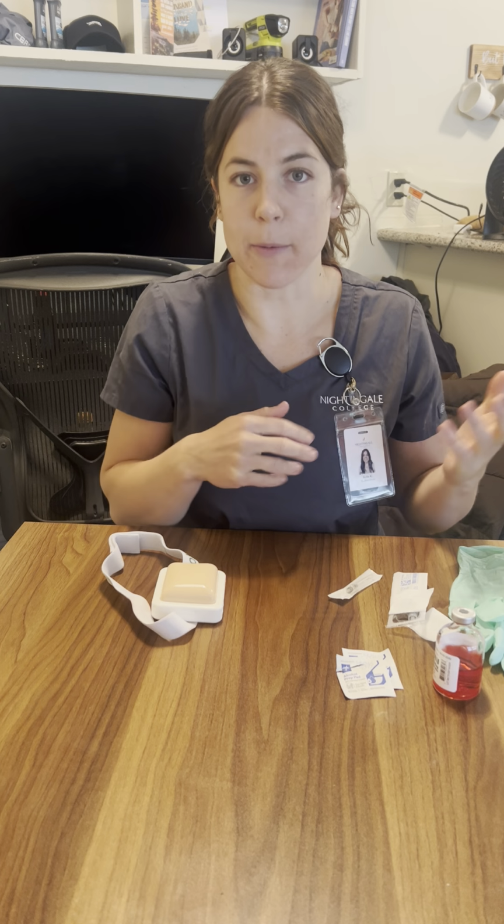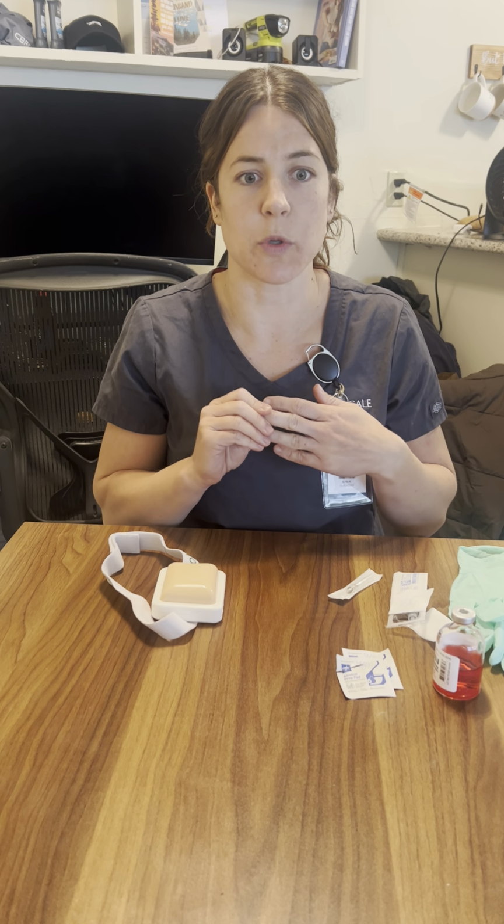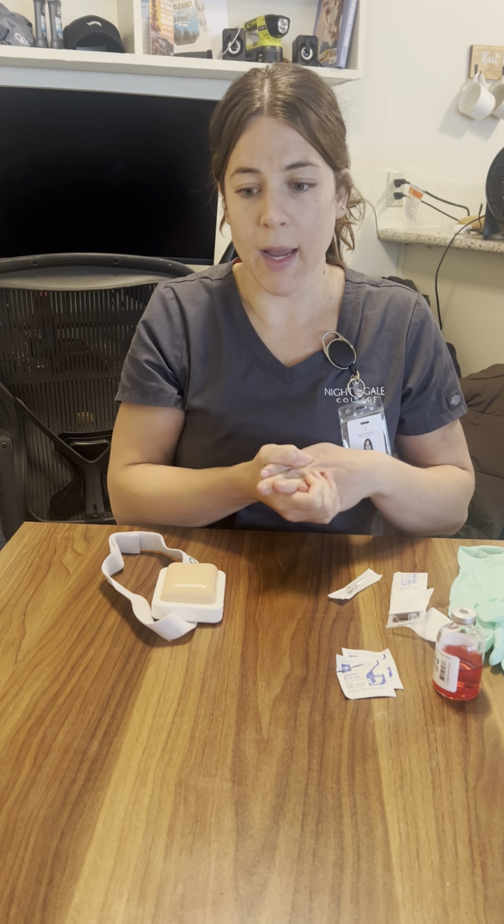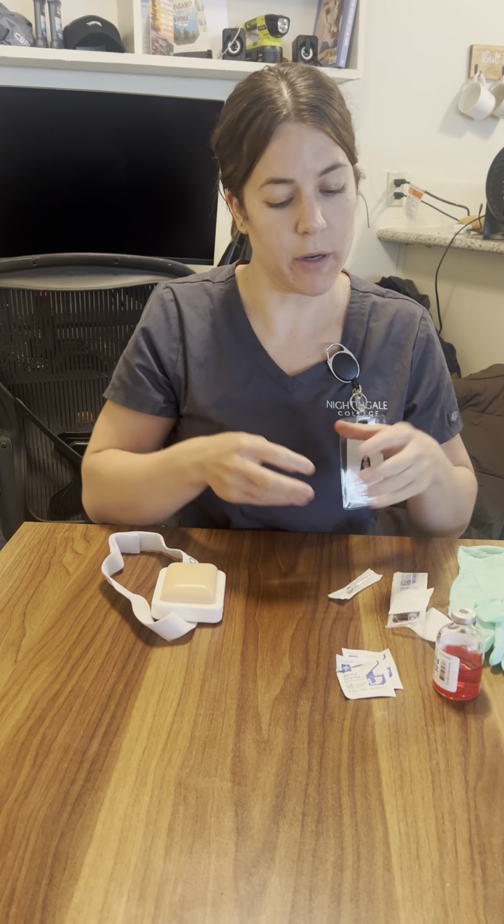So once I've done my dosage calculation, I will gather my supplies and I will head to the room to perform the injection. So once I've reached the patient's room, I'm going to close the curtain for patient privacy. I will perform hand hygiene and begin. Hi, my name is Kylie. I'm going to be your nurse today. Can you verify your name and date of birth? Verifying with 2 patient identifiers since it's medication.